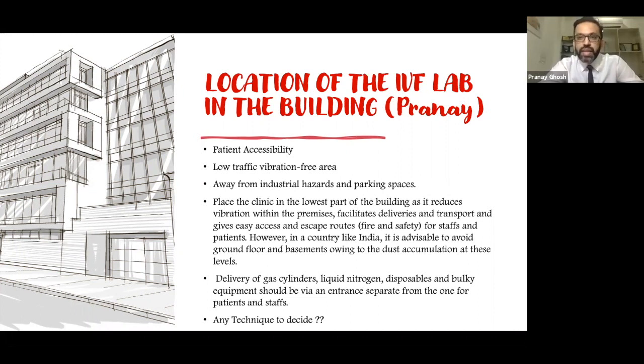They also provide easy access and escape routes during emergencies for the patients and the personnel. But that being said, in India, I wouldn't recommend building a lab in the basement or the ground floor, because it is very prone to dust accumulation and settling of heavier gases. So ideally, we would locate the lab on the first or second floor.